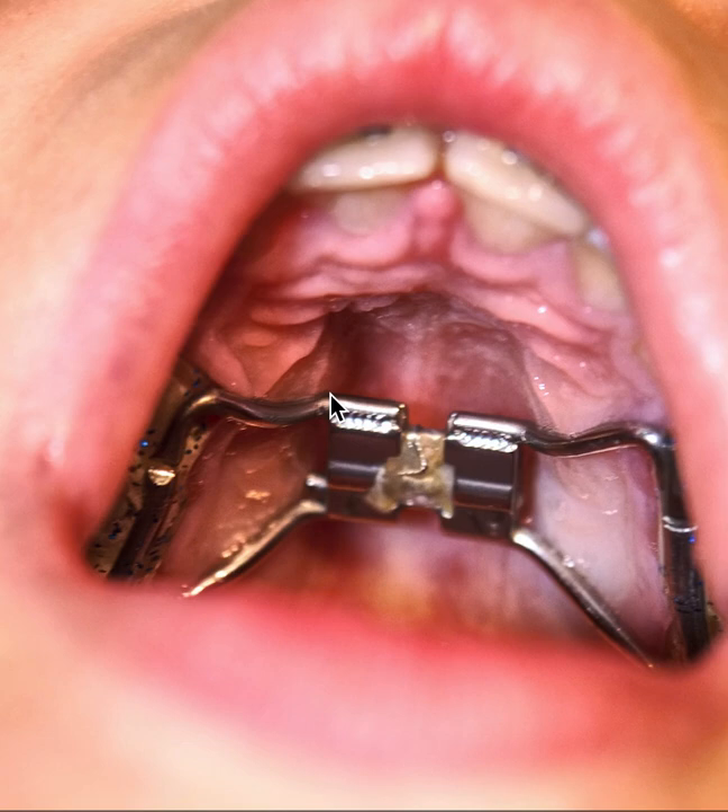They come in all different shapes and sizes. They may have things covering the tops of the teeth. They may have some acrylic or plastic on it. They may just be metal. They may be all plastic. But what they generally have in common is there's a kind of a wheel and cog jack screw in the middle that has a key, and you as the parent generally activate it.